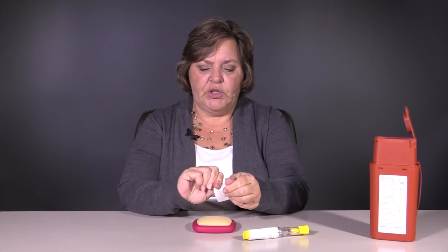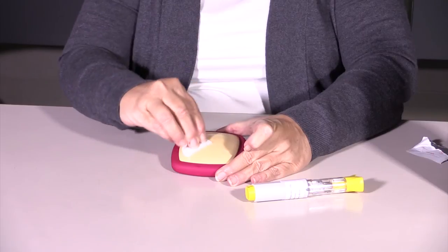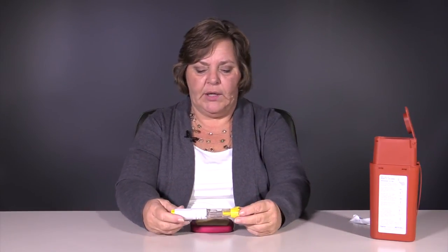What you're going to do first is prepare the injection site, and to do that, we're just going to clean that off with a little alcohol wipe, just in a circular motion for about 30 seconds. Once your area is nice and clean, you're going to let that dry. It should dry very quickly — alcohol evaporates very quickly.